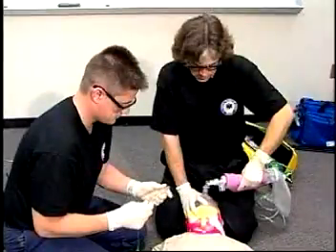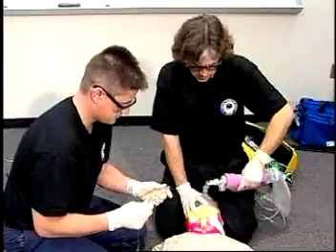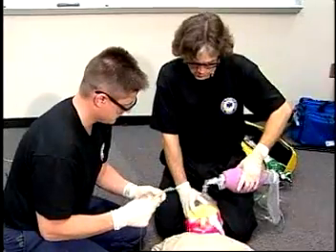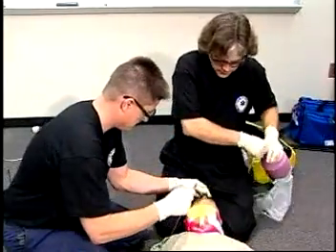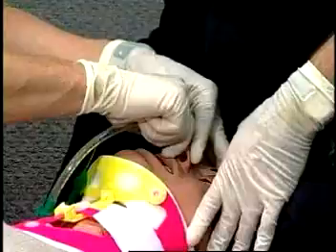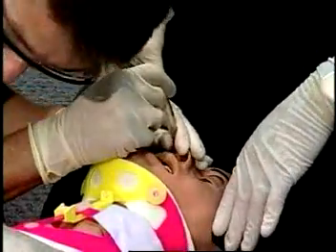The first provider maintains neutral inline stabilization of the patient's head and neck. Advance the tube into the selected nostril, guiding it in an anterior to posterior direction.